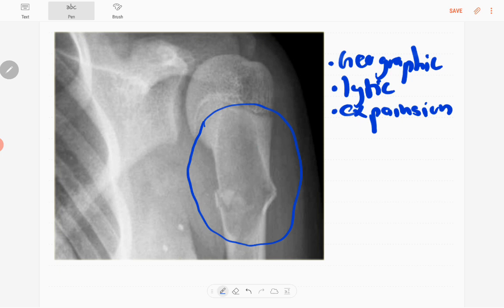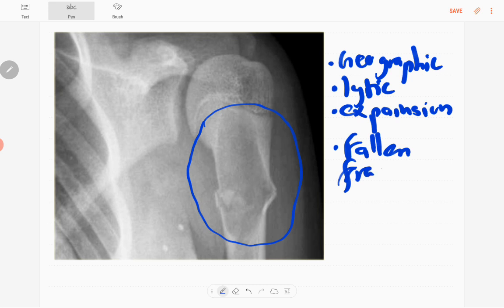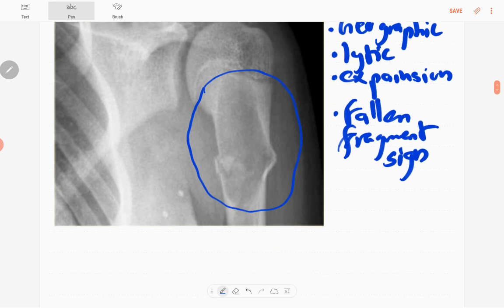You can see a cortical breach in this metadiaphyseal region, representing a fracture. There is a fracture fragment visible within this lesion — this is called the fallen fragment sign. It can be seen in the dependent part of the lytic lesion and is a feature of this specific diagnosis.